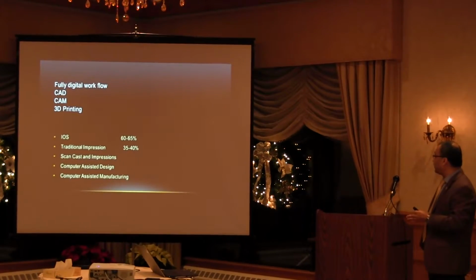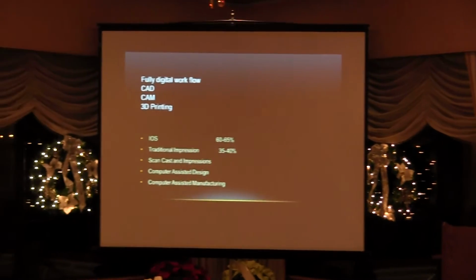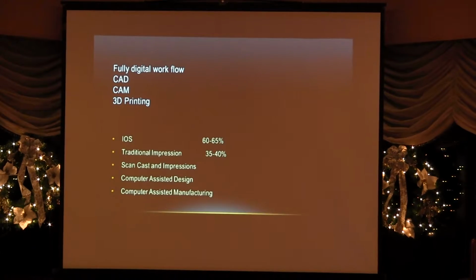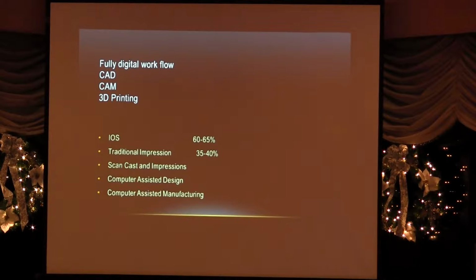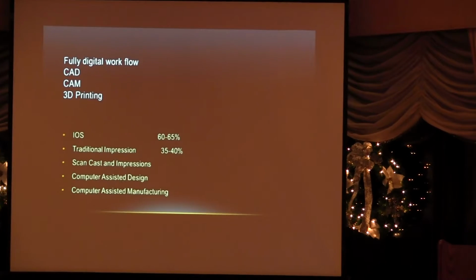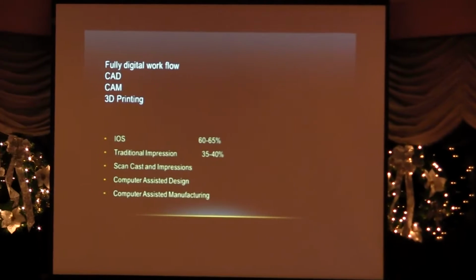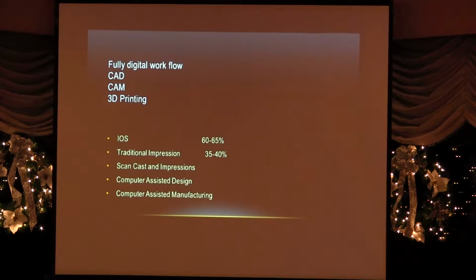So what I'm going to do here, I'm going to go through a few slides of the lab procedure, and then we're going to go to a video of me designing an Encode, actually it's a Zimmer DSV case, Encode, and then a custom abutment and a crown and a model if we have enough time left. So my lab is fully digital, meaning either you take a digital impression, we will work through that, or you take an analog impression, we're still going to digitize it and work with our CAM software.